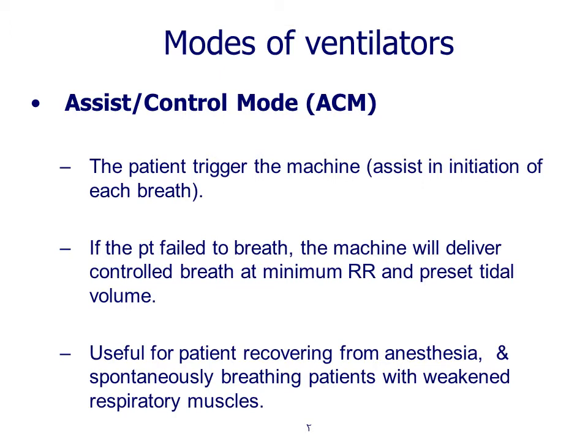Useful for patient recovering from anesthesia، عملية الصحصحة من الأنستيزيا, especially for patient with weakened respiratory muscle.